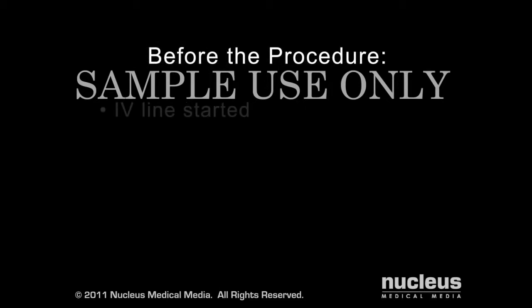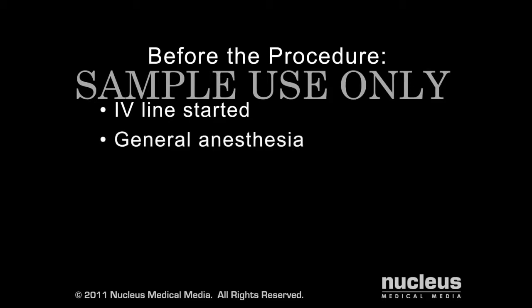Before the procedure, an intravenous line will be started. In most cases, general anesthesia is used to put the patient to sleep for the duration of the procedure.